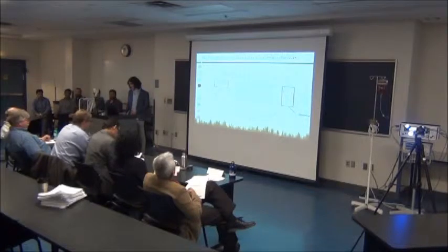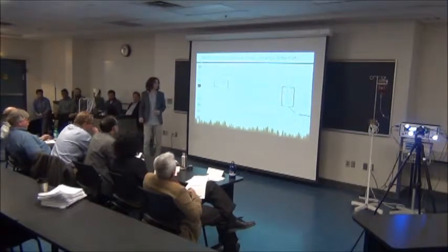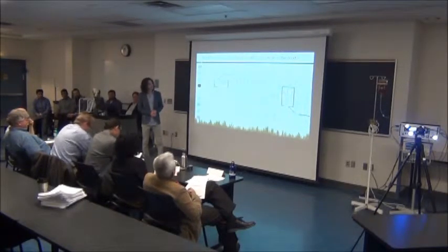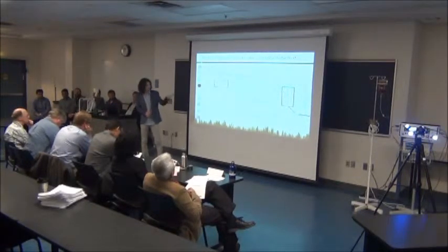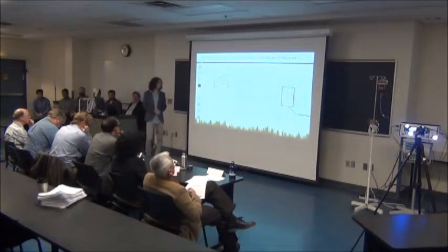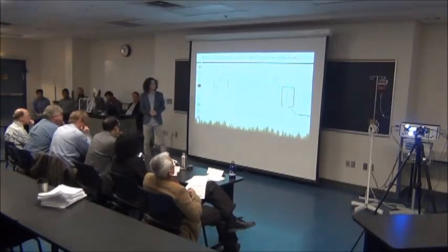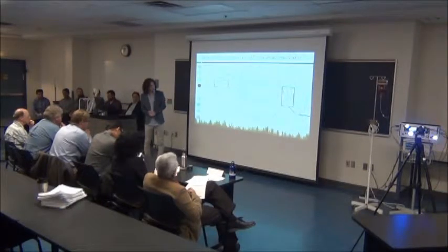This is the schematic diagram of the circuit, and we have the calibration circuit on the right side. We have the excitation circuit on the left side, and we used one board to make all these 3 circuits on one board. The rest of the components are the combination of the digital switch. We use the counter, the decoder, the inverter, CMOS switches, and relays, and then these contacts will be connected to the calibration circuit, and they will pass the signal to the signal acquisition circuit.